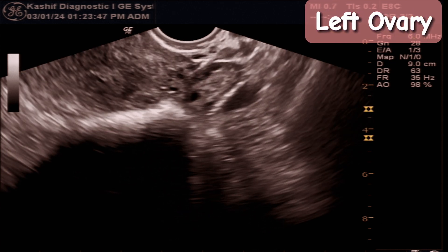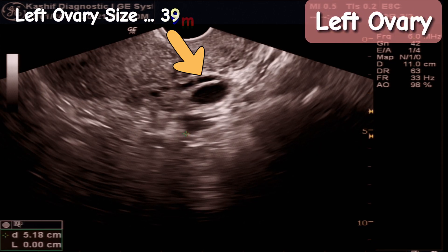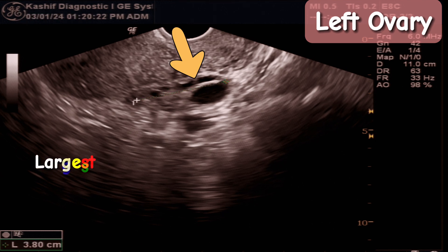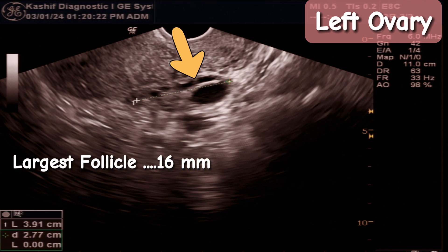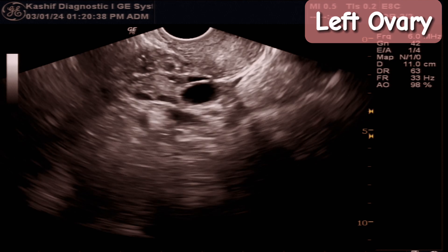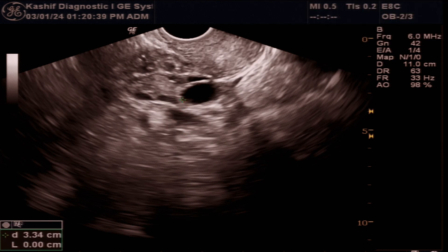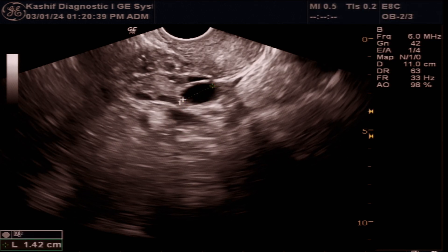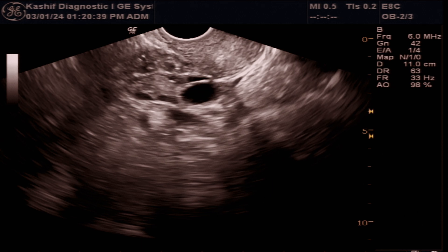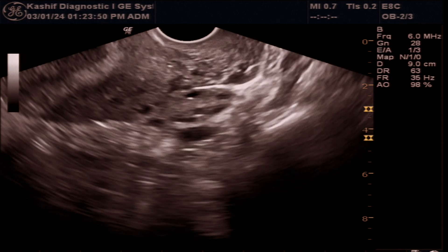The left ovary is visualized. Its size is 39 mm, which is normal. There is a well-defined follicle of size 16 mm in the ovary. This is thin-walled and filled with clear fluid. At the 9th day of the cycle, this is a good growing follicle that can mature and the patient can conceive.